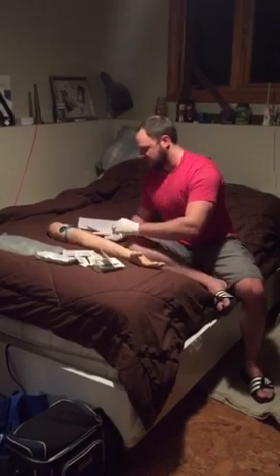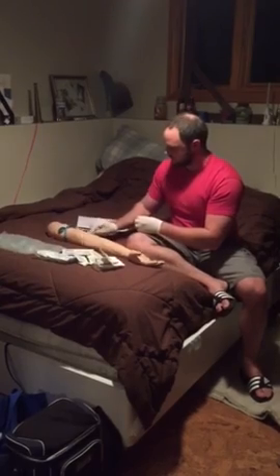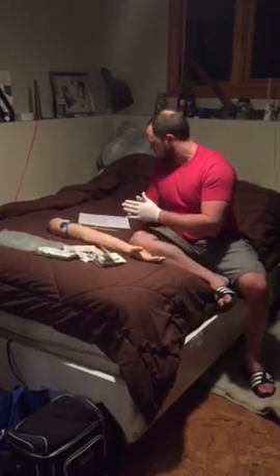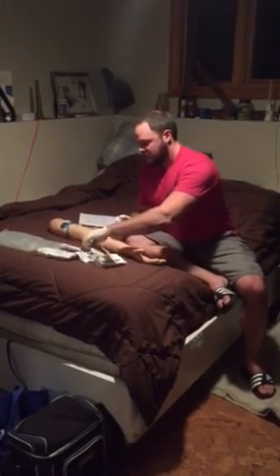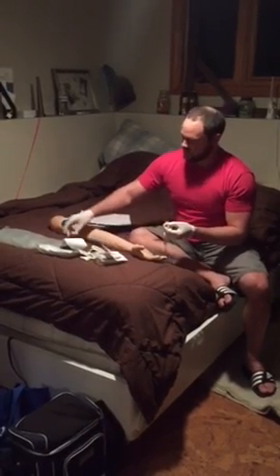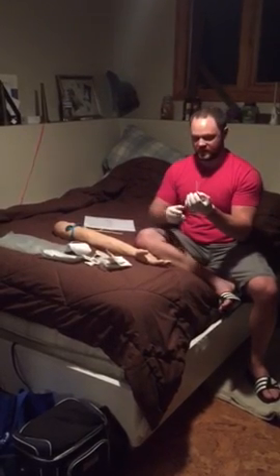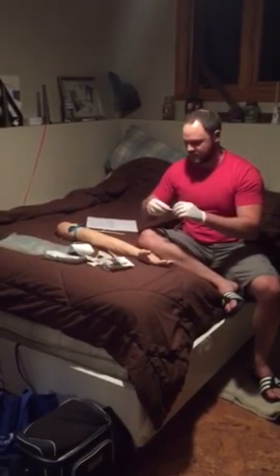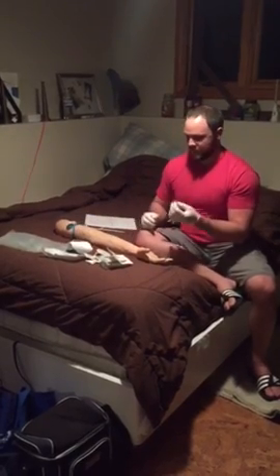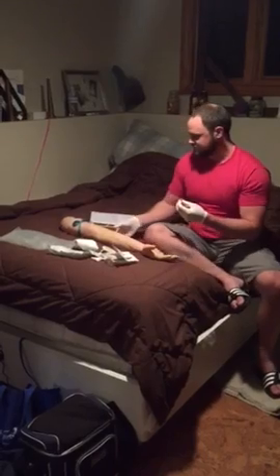Now you can touch the site after you've cleaned it, but if you touch it, you got to clean it again. So our site's all cleansed. Pop open our catheter. And there is a step in this that is actually eliminated by this catheter because this is a rather innovative butterfly catheter. So this next part is paramount.